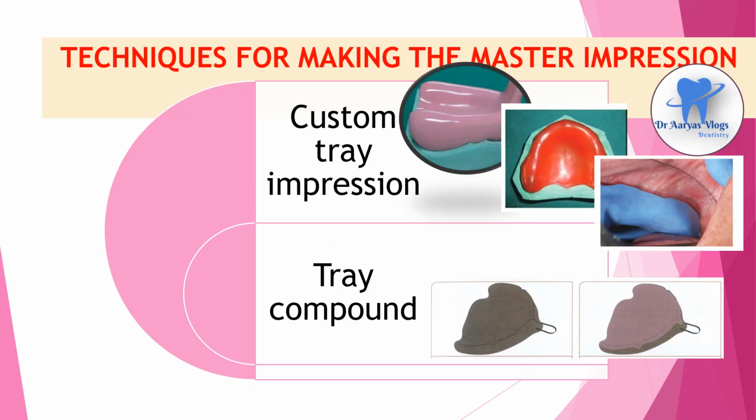There are two major techniques which are commonly used for the recording of the master impression of an edentulous arch, and they are custom tray impression and using tray compound. The custom tray impression is the most commonly used technique, and the custom tray is designed with a spacer which is adapted over the arch, and the tray should be 2 mm short of the sulcus, and the border molding should be carried out to record the sulcus in dynamic function.